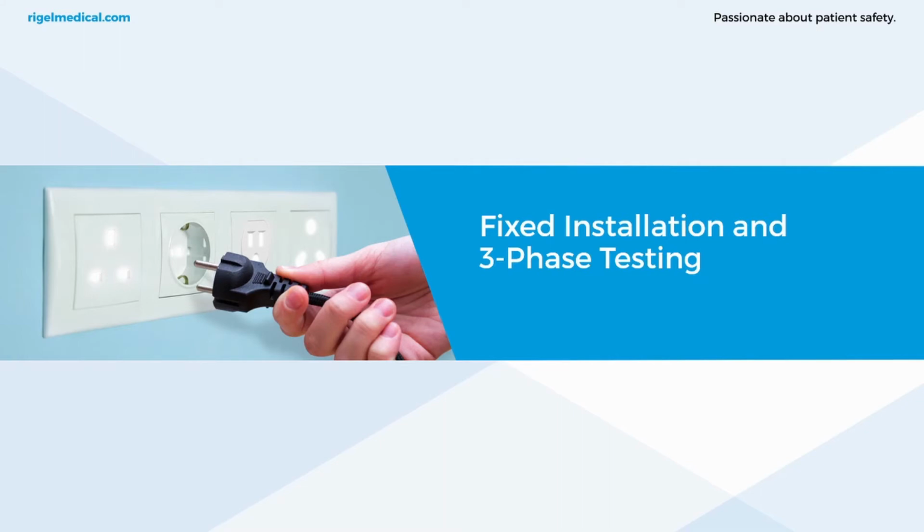Case testing in unconventional conditions. Fixed installation and three-phase testing is one example. It's becoming more and more common, especially in regards to medical imaging. You've got your traditional scanners such as CT and MRI. They're commonplace in hospitals, but you've got technologies now that are combining scanners such as your CT SPECT, and these are very large fixed devices and often three-phase to deliver that power that's required. So it's a question that comes up quite often.